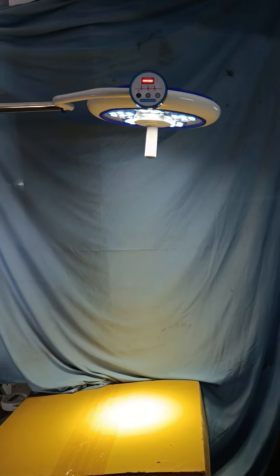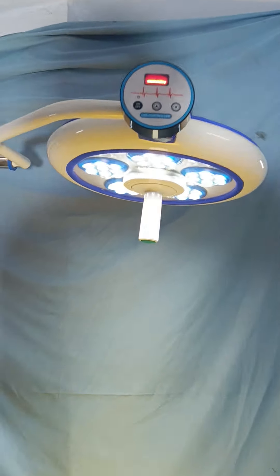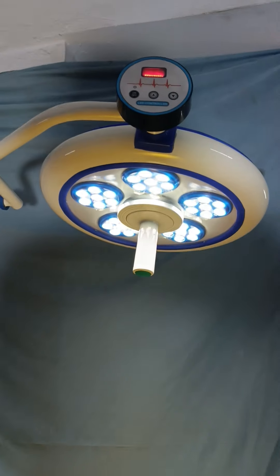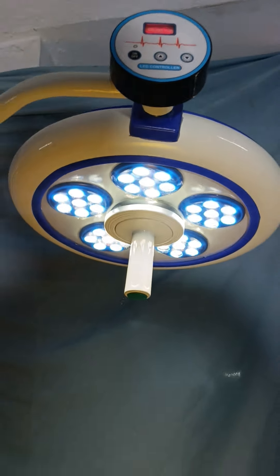This is our HOSPI Eco 35 with 7 LEDs on each single petal, and the total LED count is 35 in this dome, fully covered by safety glass. This is our HOSPI.